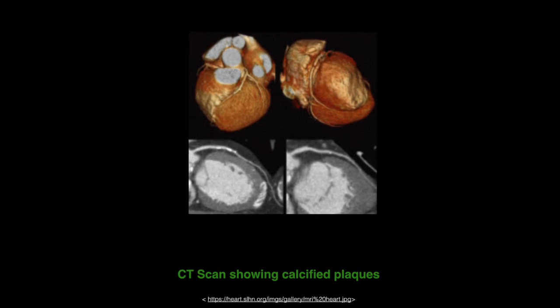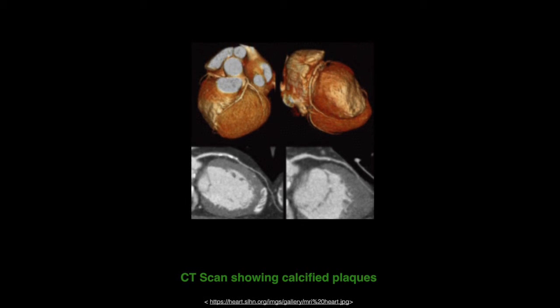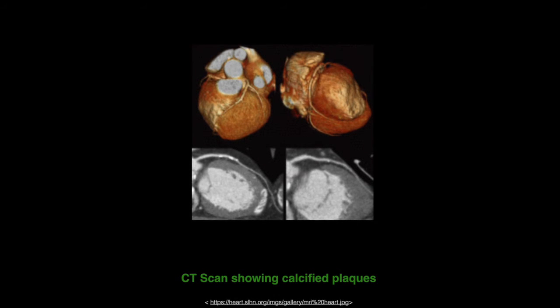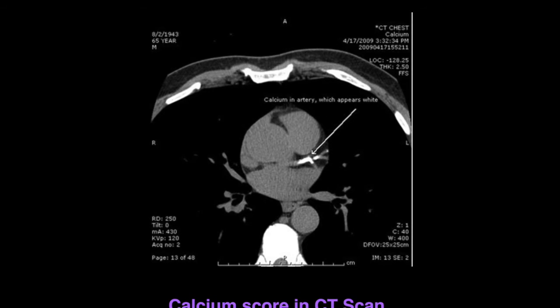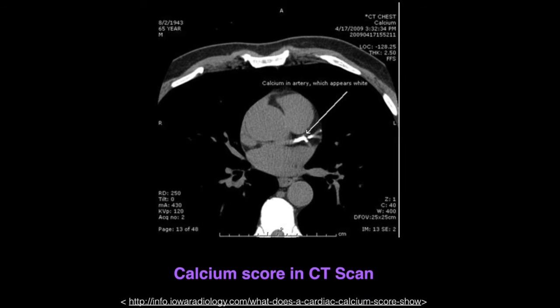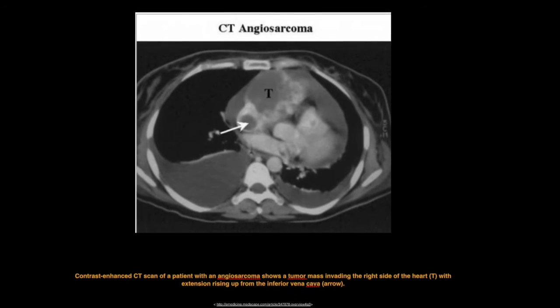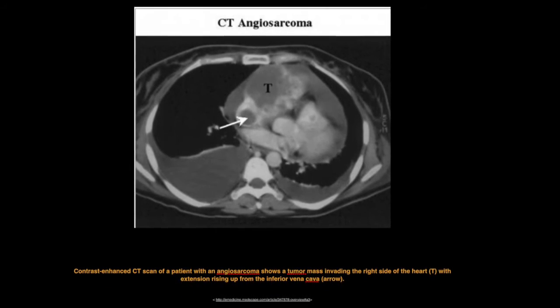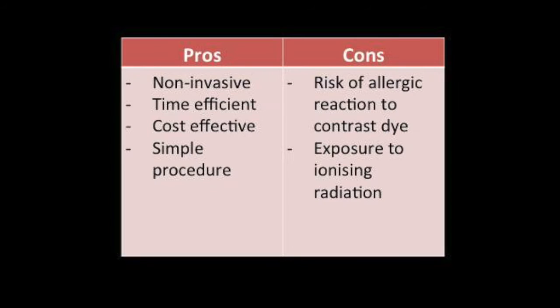An iodine-containing contrast is usually administered to the patients as it attenuates X-rays much better, improving the quality of the image. Using CT for angiography, calcium scoring, and using multi-detector apparatuses have been successful in evaluating conditions such as pericarditis, any disorders of great vessels and cardiac tumours, and for evaluating for the presence of plaque in the coronary arteries walls. So now it is important to weigh up the benefits and limitations in order to assess it.